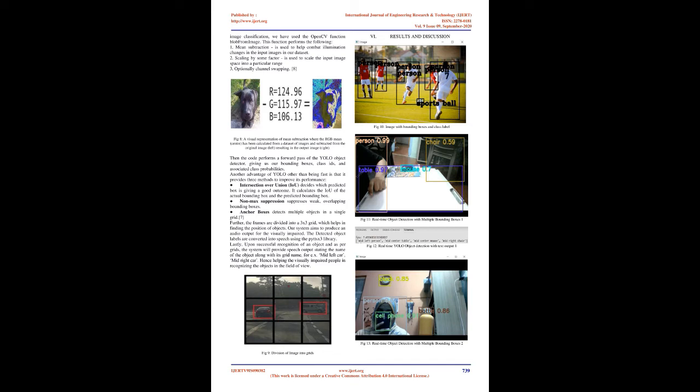Working and implementation. Fig 7, flowchart of system. The flowchart is a communication outline that shows how objects work with each other and in what order. The flowchart of our framework clarifies the flow: first, the user starts the system. Once the Raspberry Pi, RPI, is on, it will execute its internal process and code.